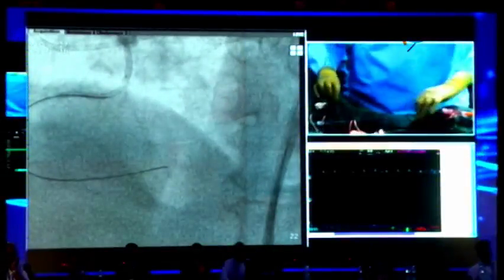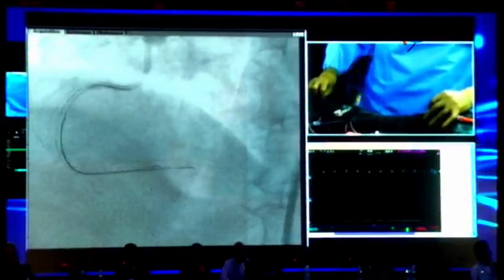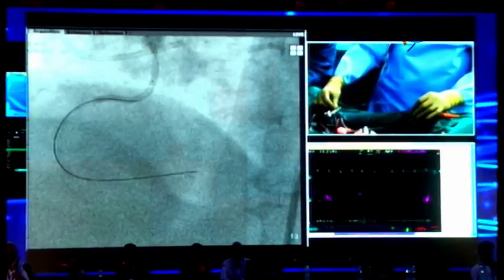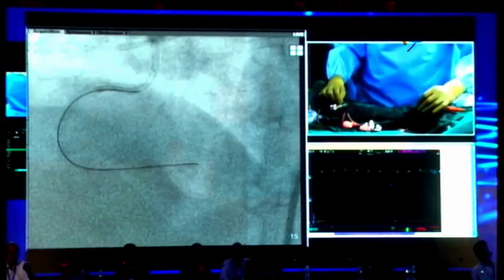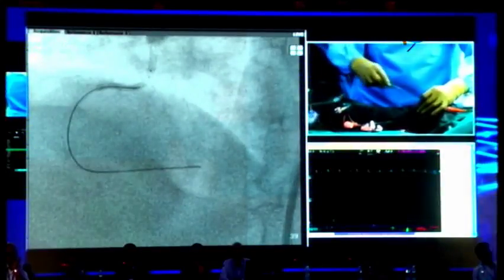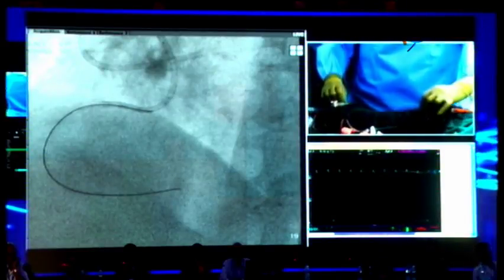Okay, can we go to the screen? Deflate the balloon. So I want you to mag up a little bit now. Yeah, go up. Good. Can you increase the frame rate? No, don't do that. You can see it. That's good enough. No, seriously, we'll not be able to see. We cannot see, but anyway, you are seeing.